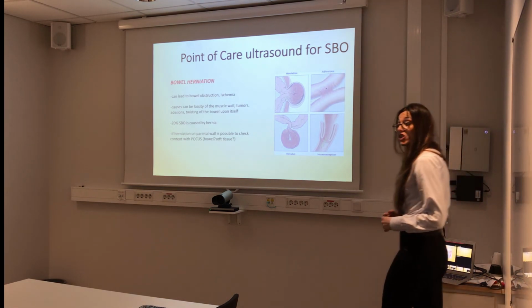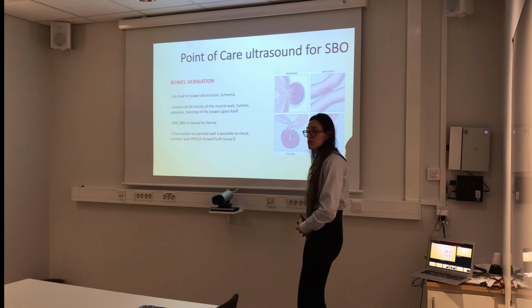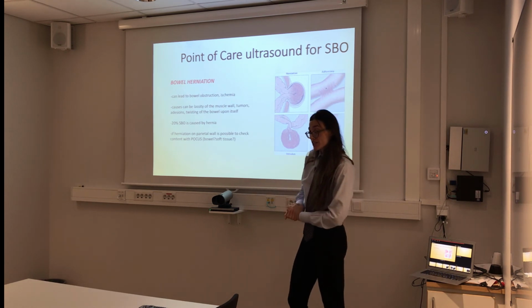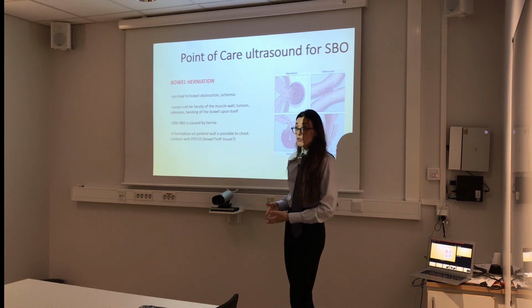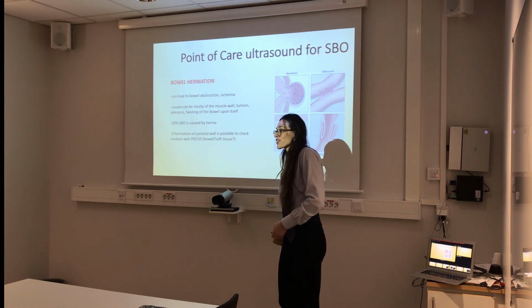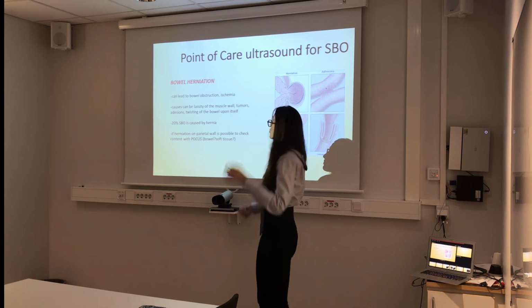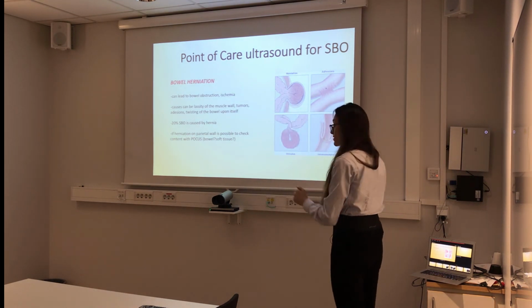And then another thing is the herniation. So basically, many old people come with a hernia, and you say, okay, it's an incarcerated hernia, or it's just fat in the hernia. What can you do with the ultrasound? Well, the ultrasound is even better than just listening over the hernia for bowel movements, because you can spot them straight away and you can see whether there is bowel content in the hernia.